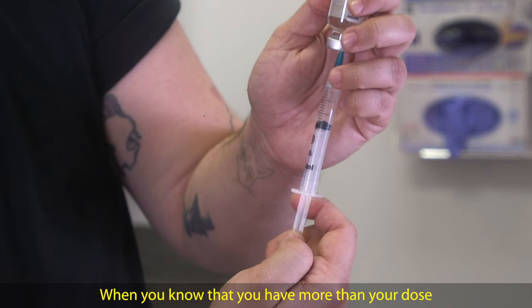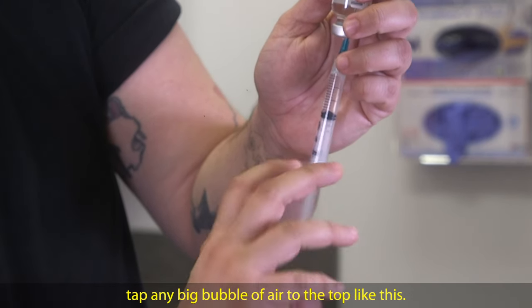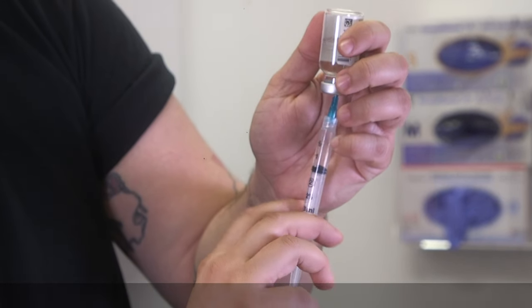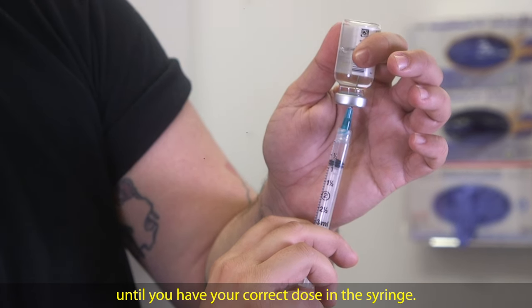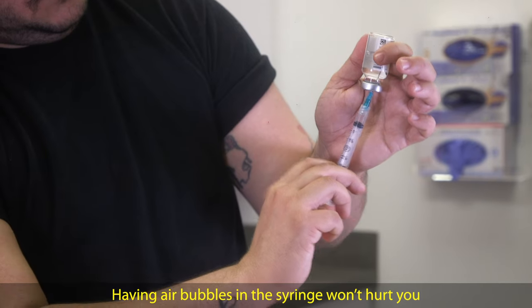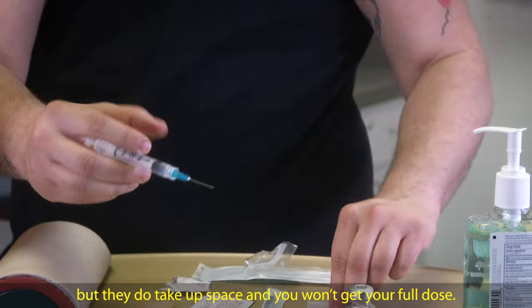When you know that you have more than your dose of hormones in the syringe, tap any big bubbles of air to the top. Then push the air and extra hormones back into the vial until you have your correct dose in the syringe. Having air bubbles in the syringe won't hurt you, but they do take up space and you won't get your full dose.